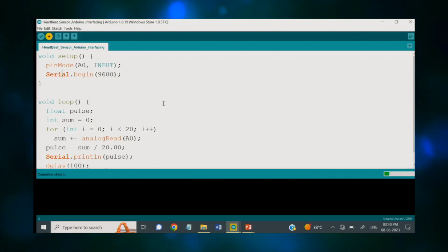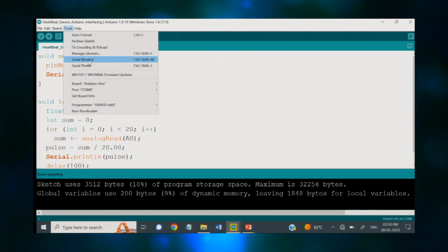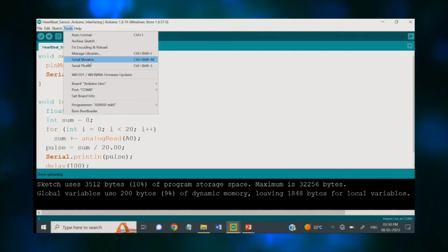It will quickly send your code to the Arduino board, and you can see here it first says compiling sketch and then uploading sketch. After this, as it is uploaded, I can now go to the tools section, and you can see here we have two options, one is the serial monitor and the other is the serial plotter. So, as I already told you, we will be plotting the pulses that we get from the sensor.